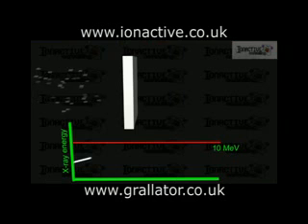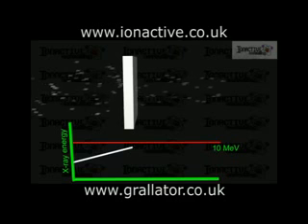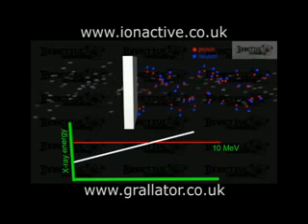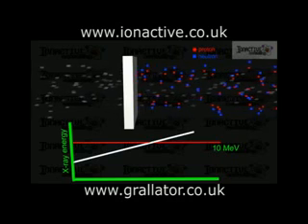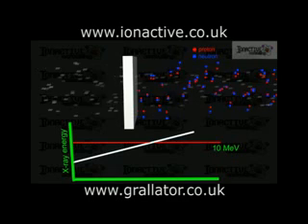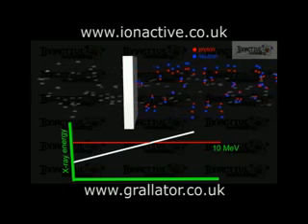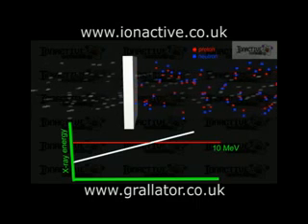When the LINAC is used as an X-ray source for X-ray photons above about 10 MeV, the photons can be absorbed by the material in the treatment head, activating them and releasing neutrons or protons. This reaction has a threshold energy, so no activation is seen for X-rays below about 10 MeV. Any neutrons produced contribute to the dose delivered to the target or patient, while any protons produced are usually absorbed within the treatment head, leading to little or no extra radiation hazard.